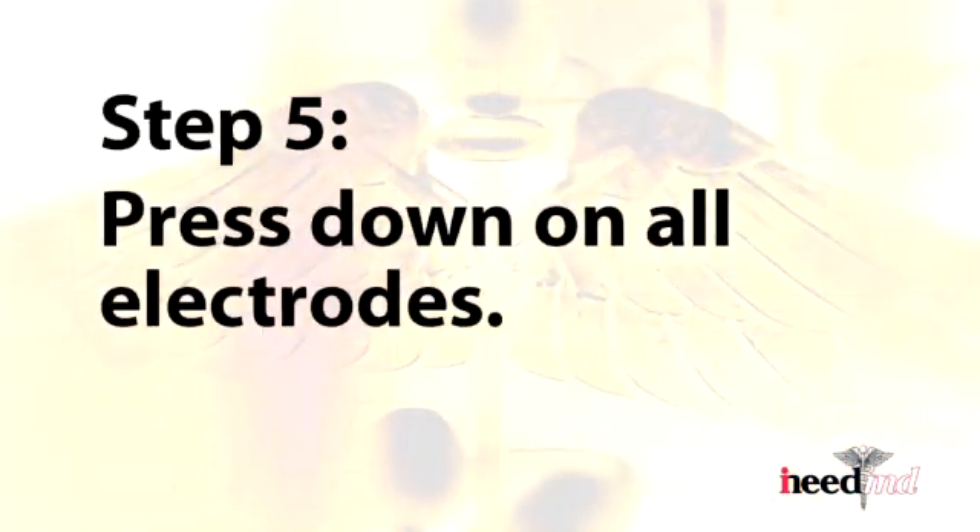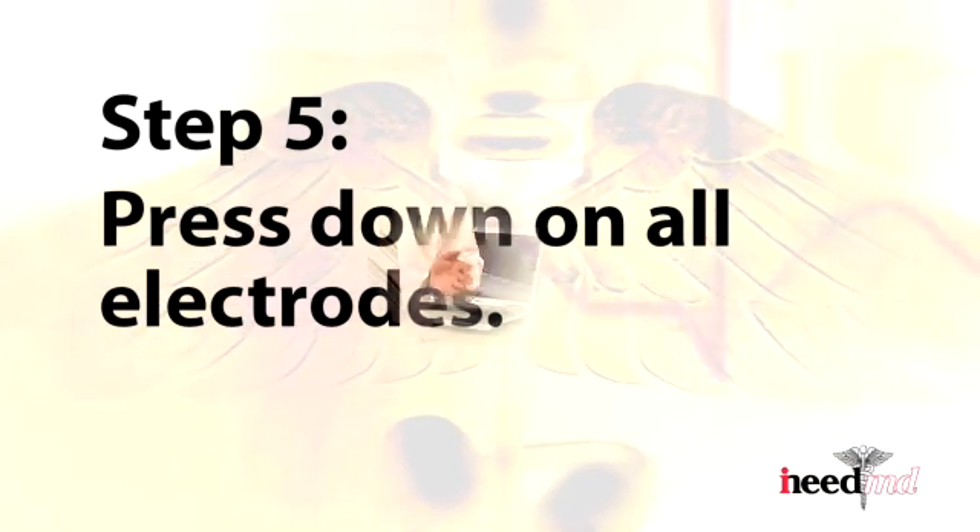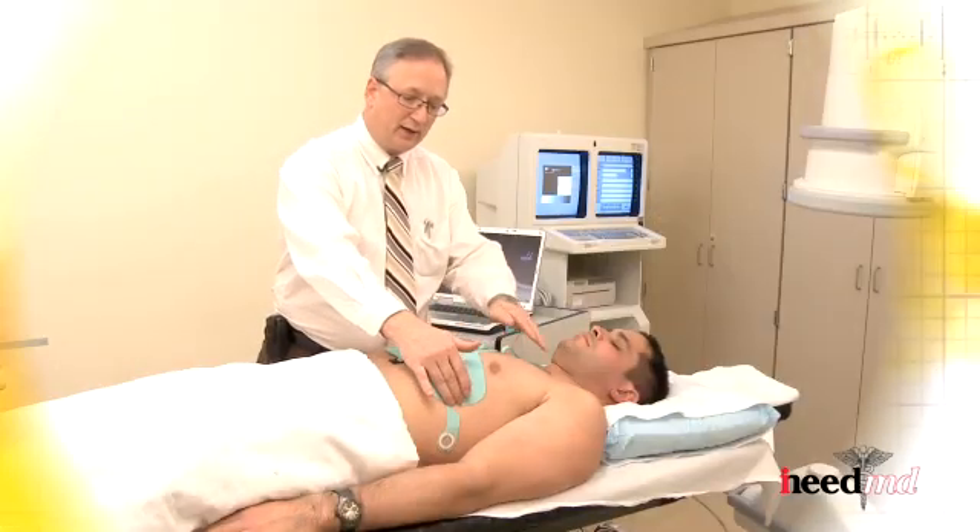The next step is to press down on all the electrodes, making sure you have good contact with the skin. There are ten locations.